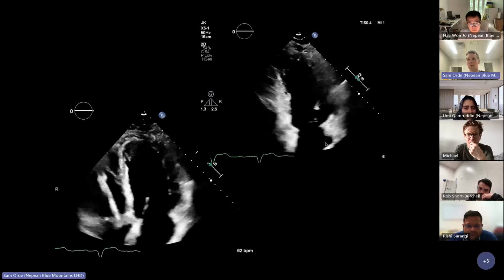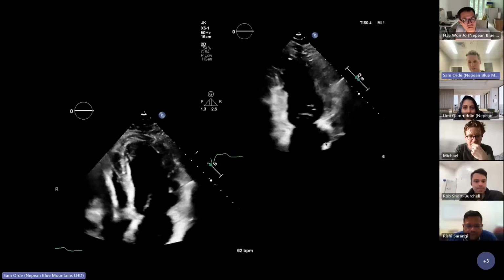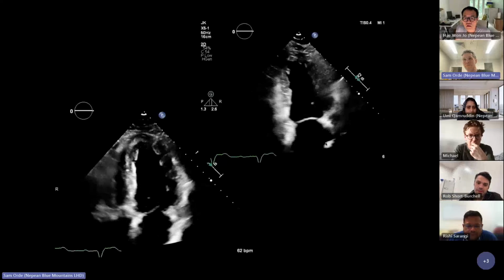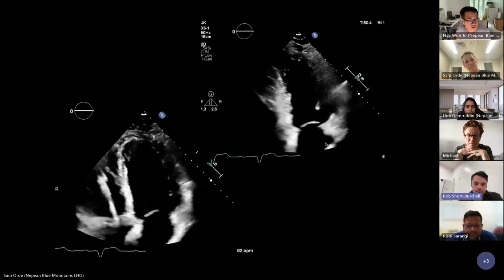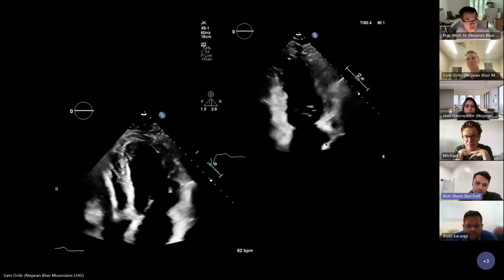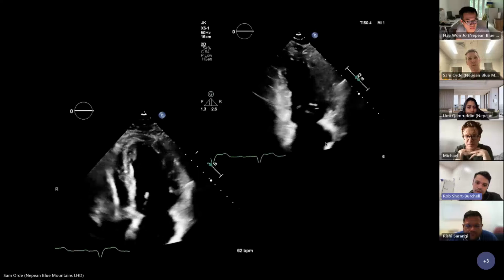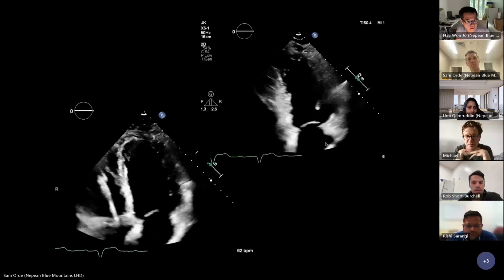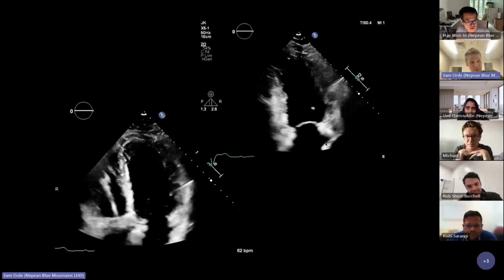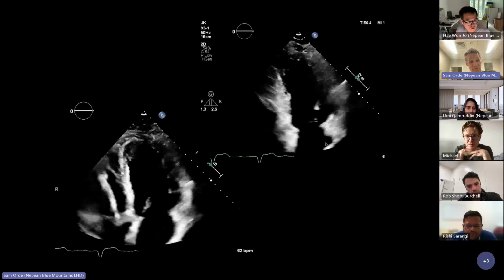Okay, Rob, how about this one? What do you reckon? I can't remember the clinical story for any of these patients, but it's probably academic. So we've got an apical 4 or an apical 2-chamber. To me, the systolic function appears impaired. Yep. Probably. And you're allowed to get away with that as you look at this, but as in the exam, you're going to tell me whether it's mild, moderate, or severely impaired, right?